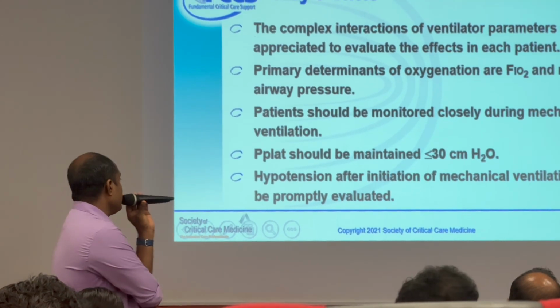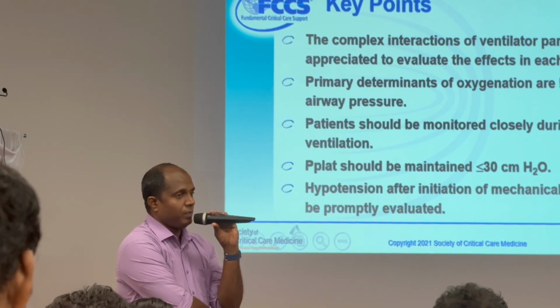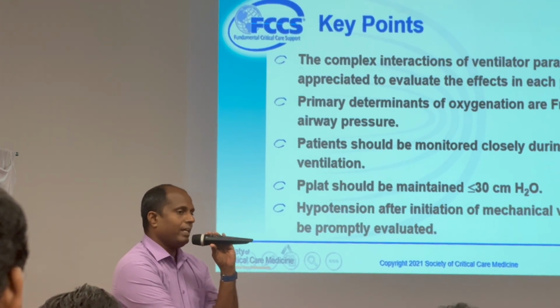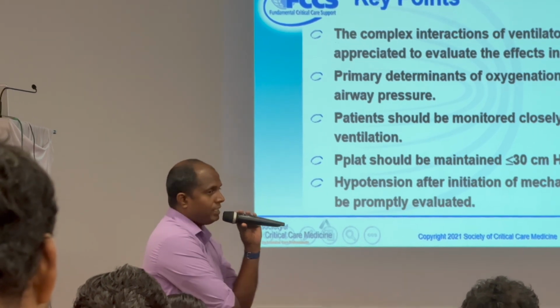Then COPD is almost similar to asthma, but you don't need to worry much about the CO2 because the body is already adapted to more CO2. These are the three case scenarios.